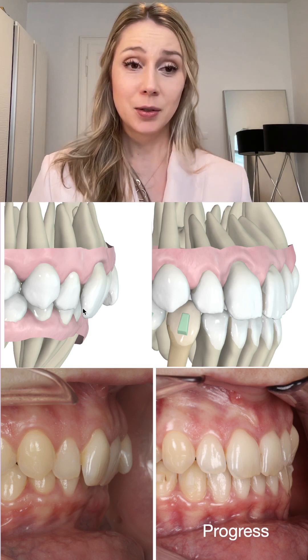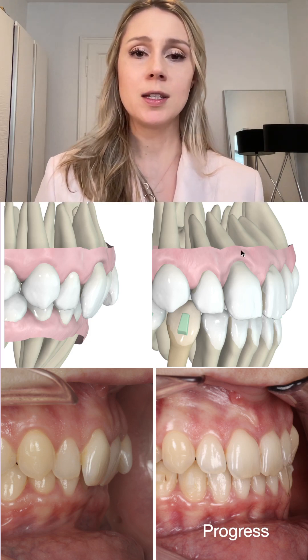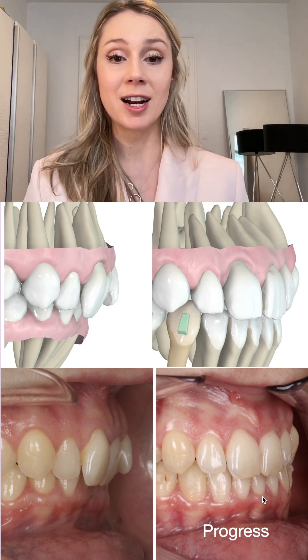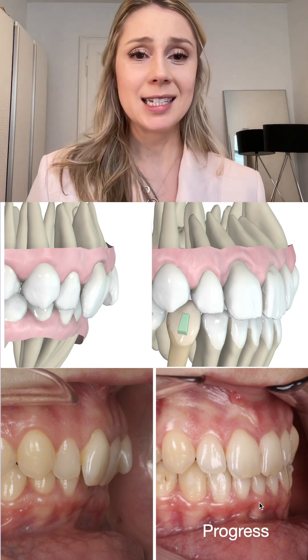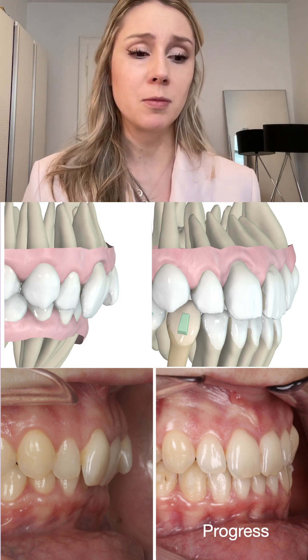Using the approval software, you can compare: here is the beginning, and here is the progress at the corresponding aligner stage alongside the actual clinical progress. I think the expression is quite good — maybe not 100%, but I would say up to 80 to 90% expression.